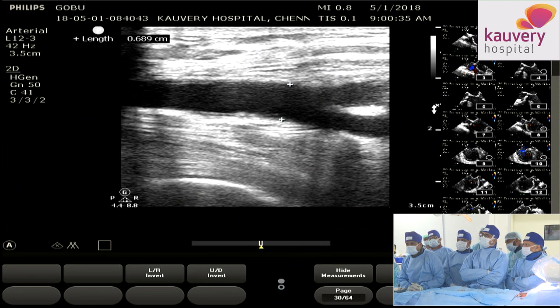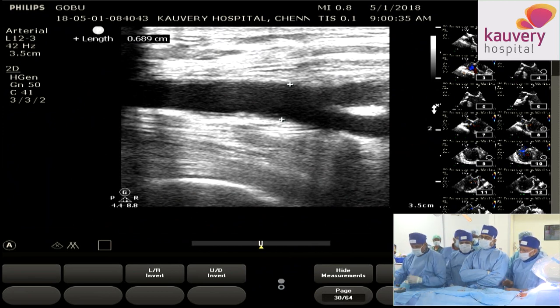There's a question from the audience. What is the coronary height? And what is the measurement of the sinus? Well, that's an interesting part. Let me just tell you that this is a post-bypass patient, and his grafts have been just checked. The LIMA is functioning all right, and the right artery and the OMs are also grafted.